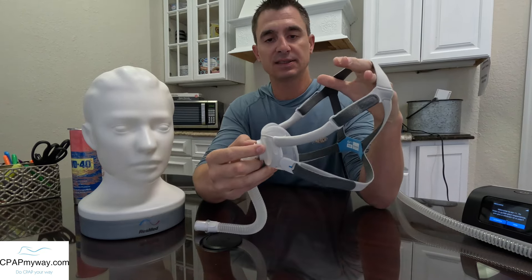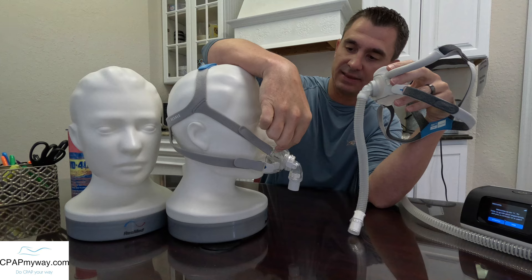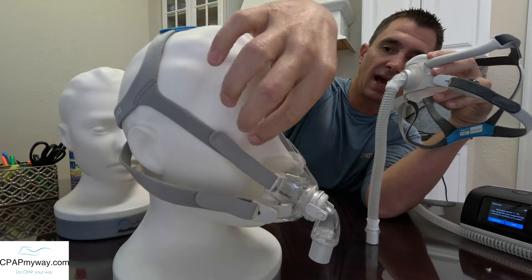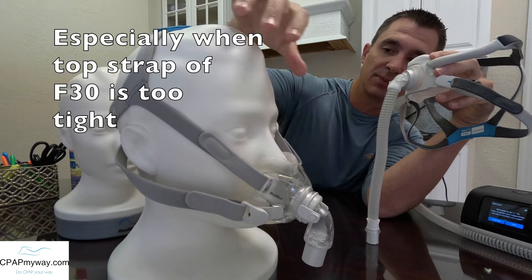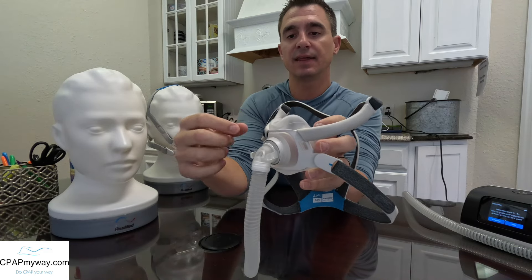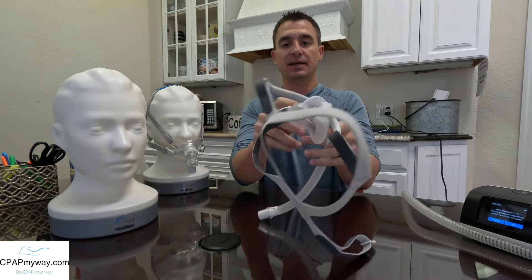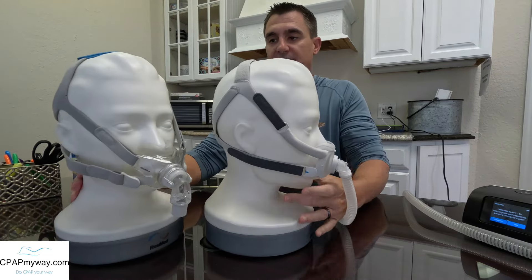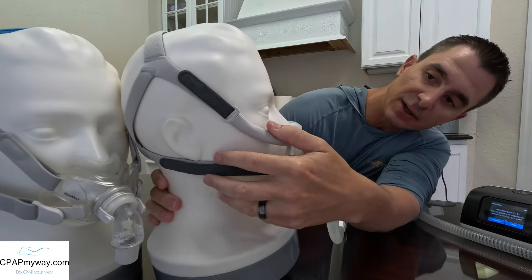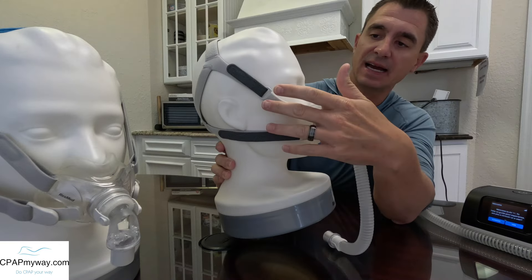On the mask frame, I want to point out that on the F30, the headgear attaches right there at the nose and runs up close to the eyes — that's been a complaint. You can see how close that headgear is to the eyes, and we've had some people say it has caused irritation. On the F40, there are wings that are part of the frame that get the headgear a lot further and wider on your face — a little further away from the eyes. When I side-by-side them, you can see the headgear lines up close to the eyes on the F30, and on the new one it pulls it a lot further out to the side and up because of the way it attaches to the frame.